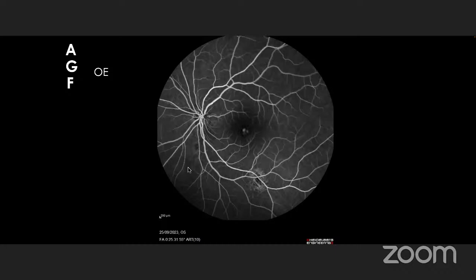Mesmo em miopia degenerativa, esses patch atrophies que aparecem são originários de doenças de membranas inflamatórias e não a clássica CNV do míope que a gente vê em lacquer cracks. E ela sugere até imunossupressão nesses míopes em miopia degenerativa para conter essas atrofias. Então, eu diria que essa atrofia pode estar relacionada com essa lesão central, uma lesão antiga.